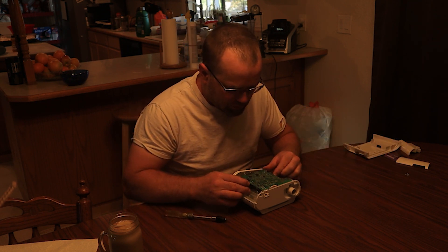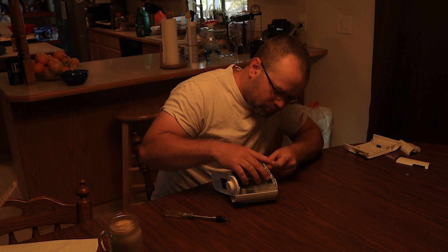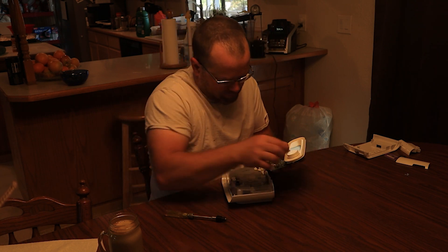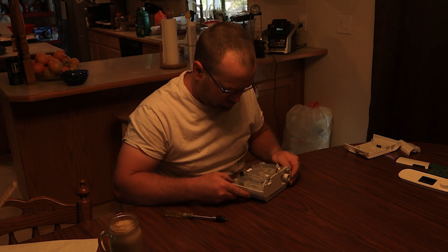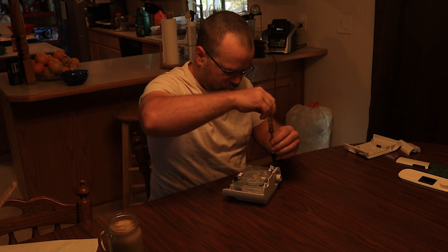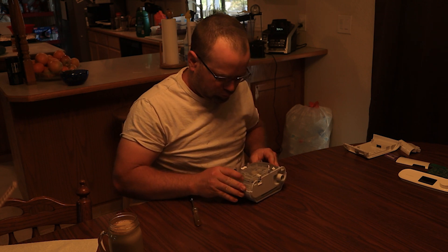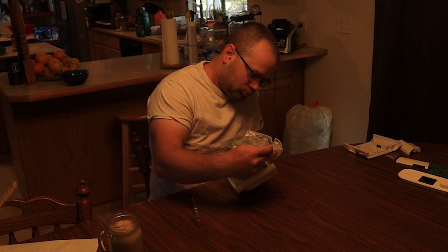I've been overall happy with this CPAP machine. I do however tend to wake up with headaches, so that is why I am modifying it. I'm going to remove the possibly toxic foam from this case.